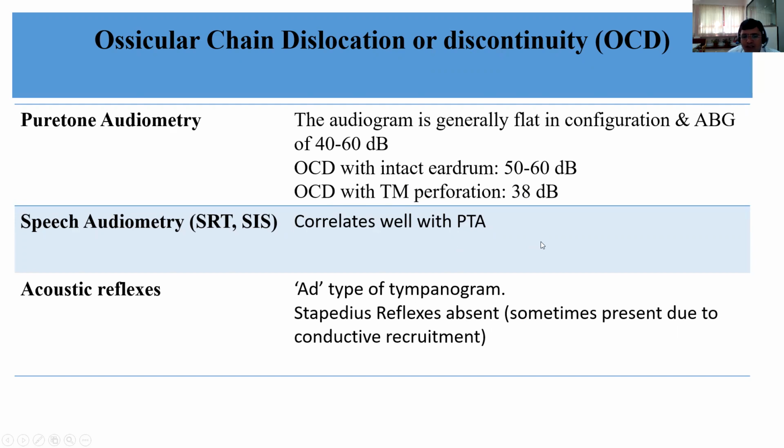And most often, as I said, when you do the tympanometry, you will get higher compliance, that is, an AD type of tympanogram. And most often reflexes are absent because of attenuation while performing the acoustic reflex test. If at all the acoustic reflex is present, it could be due to conductive recruitment. Recruitment is a phenomenon where sound at a higher intensity is perceived by the person as abnormally loud.